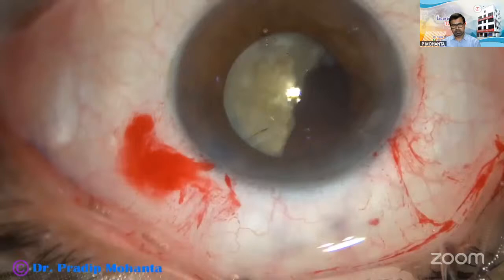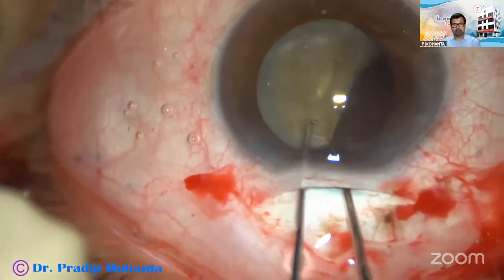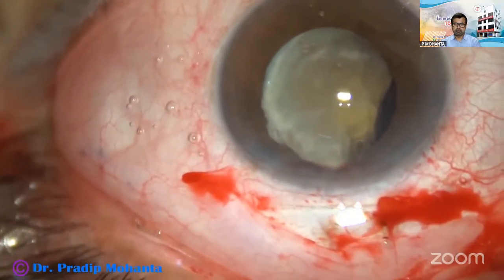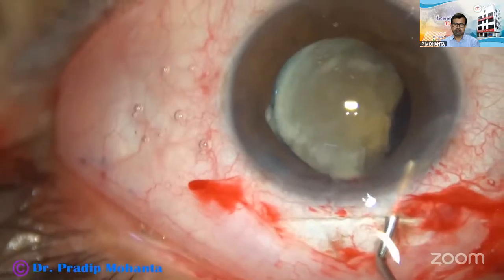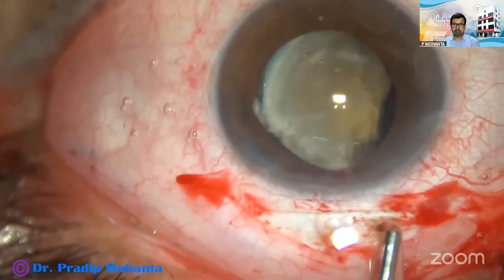And this is the last case of this presentation. Posterior capsular rent has occurred and this heminucleus is still remaining. So I convert to SICS, make the tunnel, inject visco on either side and try to do visco expression.